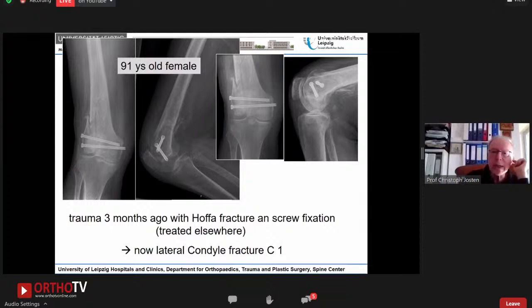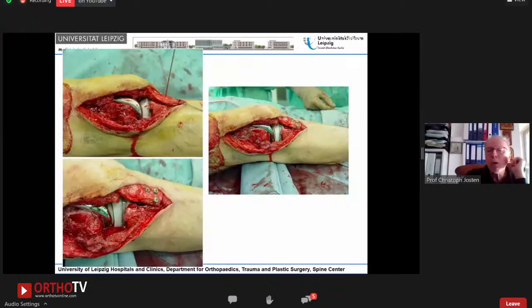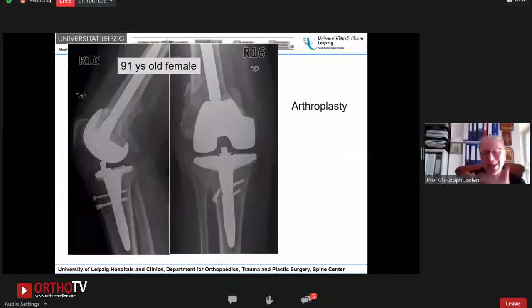And of course, you can say, okay, we make a stable plate osteosynthesis, maybe also a medial one, but then I make something and you see there's no chance for any osteosynthesis. And then we go into an arthroplasty. My message is, if you are over a certain age, and the more distal the fracture is, this is a European school that we are going more and more into arthroplasty. But I repeat, this is for very old patients, for very distal fractures.